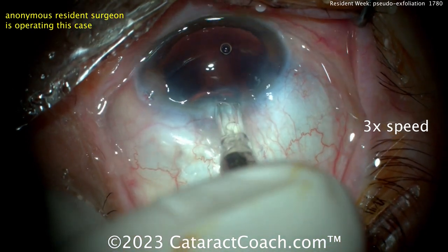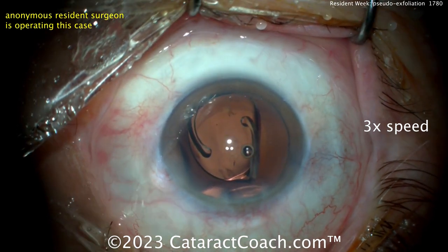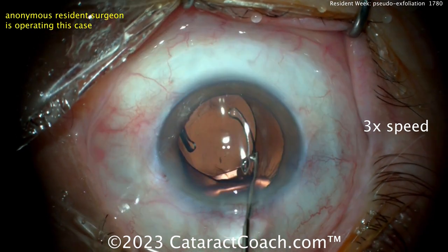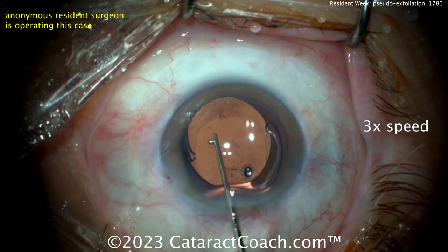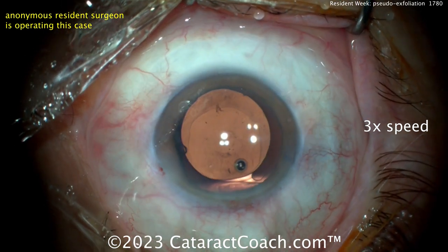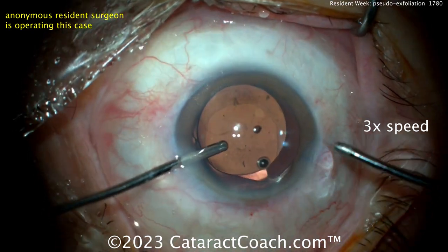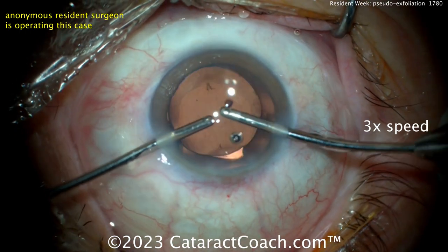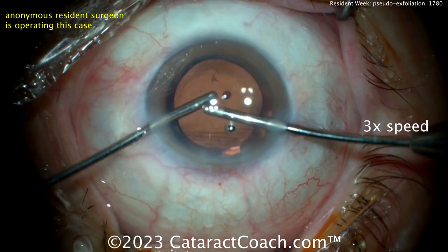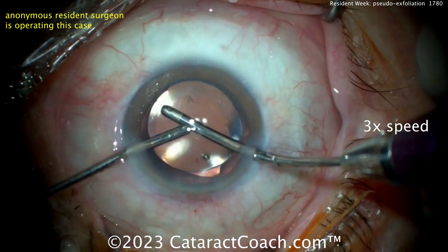Beautiful — good job. Deliver this lens nice and easy. Now bring the eye back to primary position as you inject it; don't keep injecting with the eye pushed away from you. I get why you do that initially to get the lens through the phaco incision, but once it starts to enter the eye, flatten that out and get the iris back to being parallel to the floor of the room. You may also want to hydrate the incision prior to doing the bimanual I/A, because then you don't have to use the main incision anymore — it's already done.